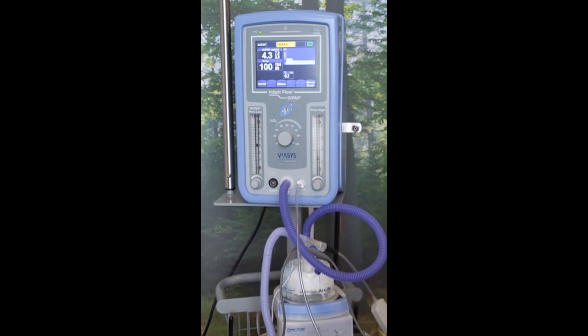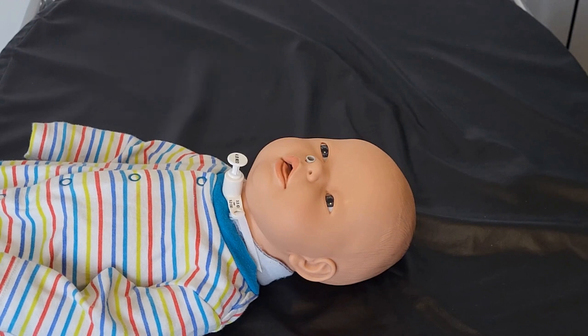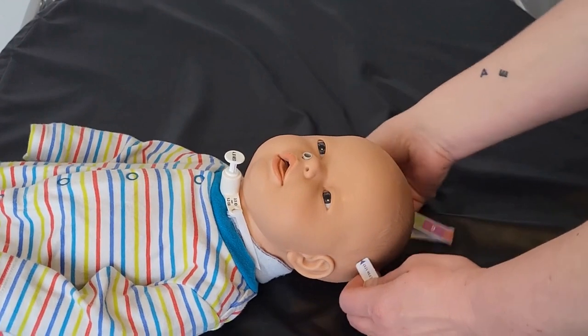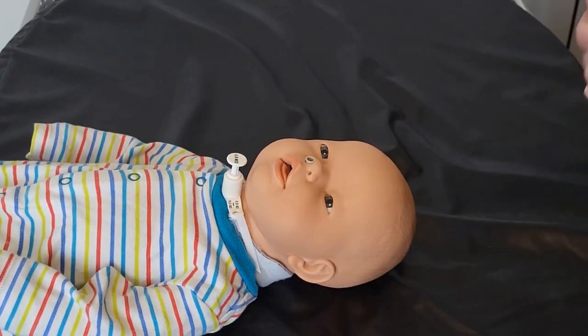We're now ready to prepare our patient with their bonnet and attach the interface. Our CPAP is calibrated and tubing is all connected, so we need to prepare our patients with their bonnets. We start by correctly sizing them using a tape measure. You take the tape measure — there's an arrow at the top — pop that round the widest part of the child's head, round the forehead. Whichever colour the arrow reaches, in this case it's six, is the size bonnet that you would choose.